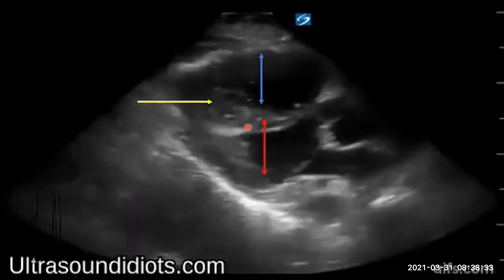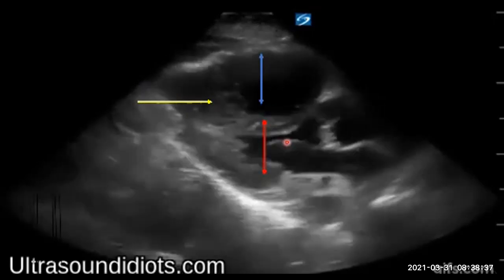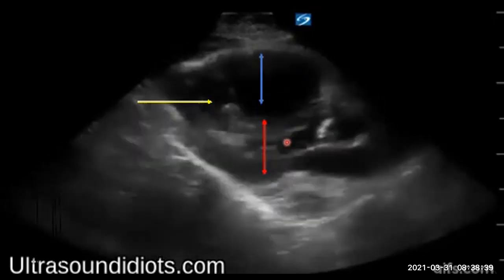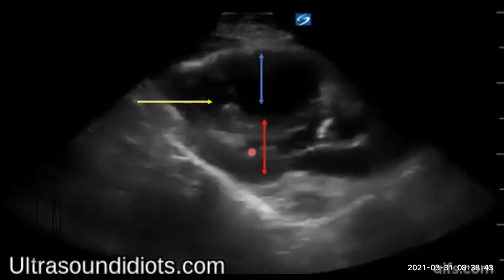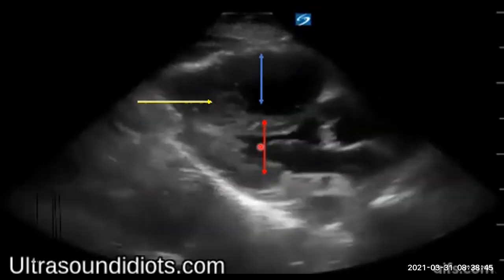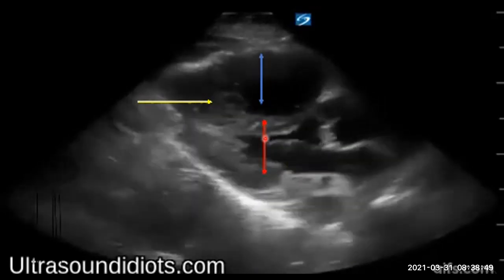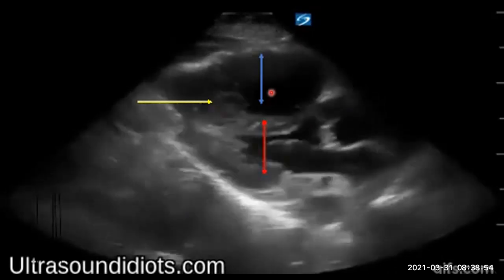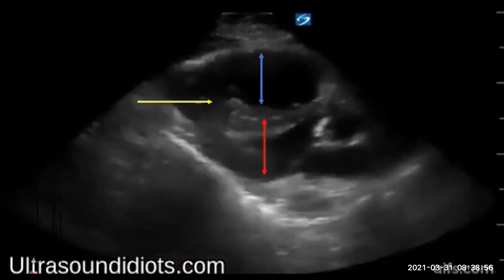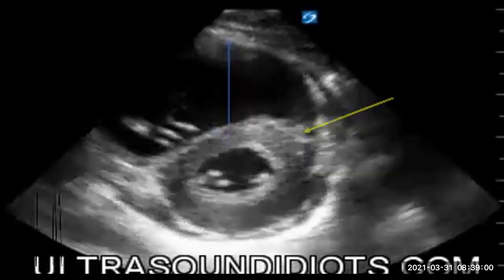We come again to our left ventricle, and what do you notice? Even our left atrium, left ventricle, what do you notice? Small, tiny, hardly visualized actually in certain points, right? And it's trying to keep up, so it's going quite fast. We can't really keep up with everything. Makes sense? So as soon as you get rid of the blockage, everything will go back to normal, right? So let's just get on to the next one. Let's see from there.